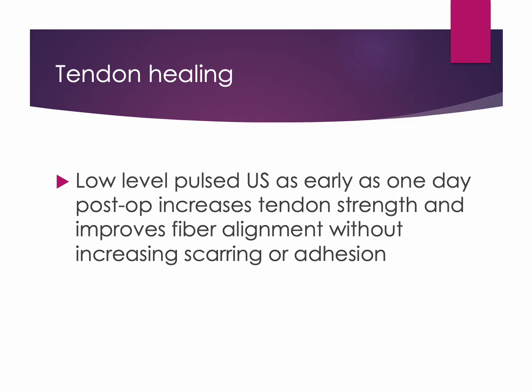Pulsed ultrasound may also help modulate inflammation and improve local tissue healing during the acute or reactive stages of tendinopathy, while minimizing the risk of excessive heating that could further irritate the tissue. Although evidence for clinical effectiveness is mixed, pulsed ultrasound is sometimes used as an adjunct to progressive loading programs during tendon rehabilitation.